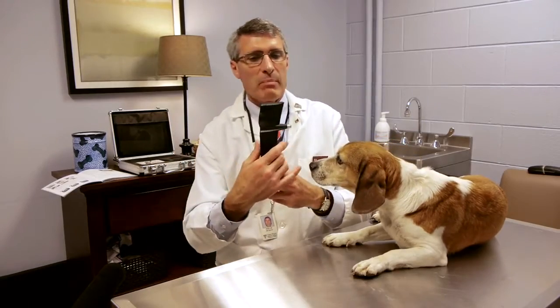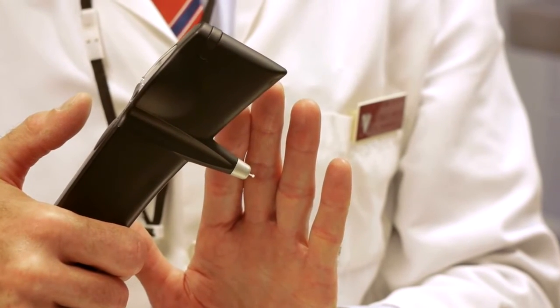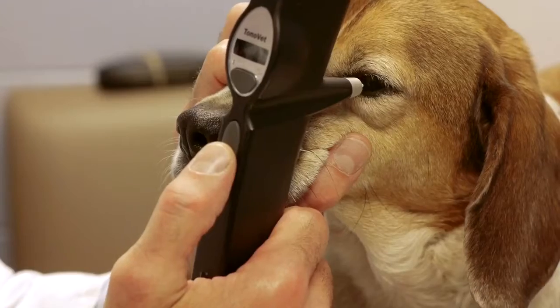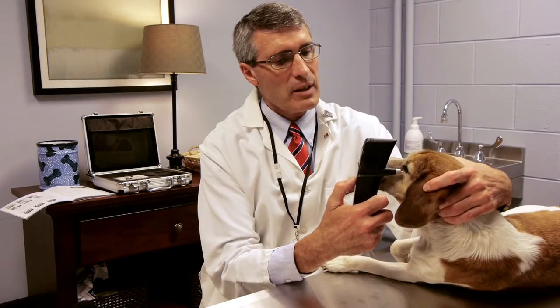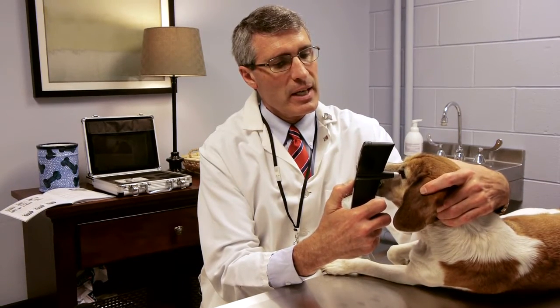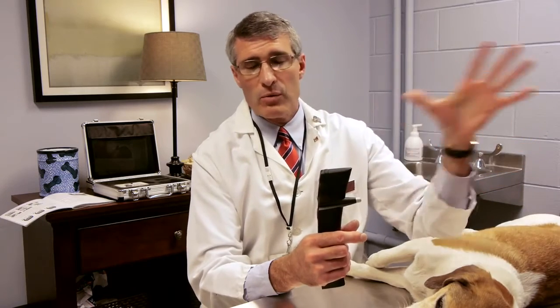The instrument needs to be held with the pen parallel to the floor. If you have the instrument too far bent down, it gives you an erroneous reading. If you have the instrument pointing up, it gives you an erroneous reading. The idea is to have the instrument close enough to the eye. When you press the activating button, the pen will be shot out and touch the cornea. You can see that the dog doesn't seem to be affected at all. Every time it takes a reading, you get a quick beep. Once it takes enough readings, these are averaged and you can read it in the instrument. It gives you an error bar that allows you to determine whether or not these readings were all precise or if they were too erroneous and you need to repeat the readings.